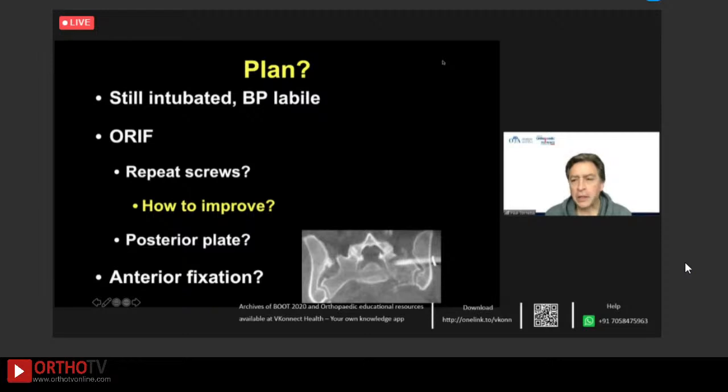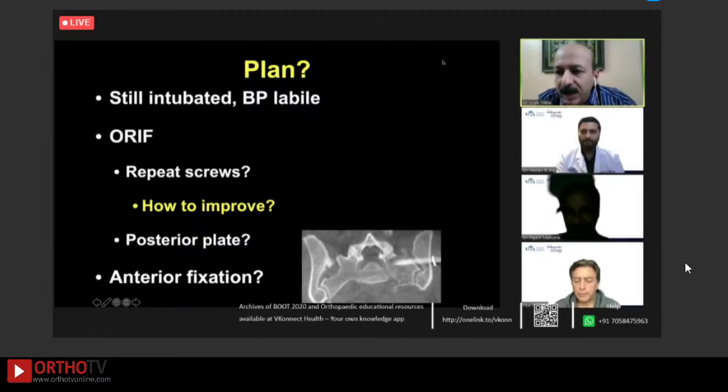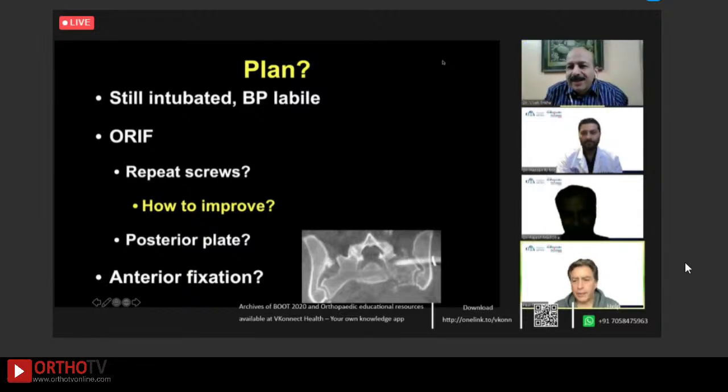In my hands, what we will be doing is, if possible, transsacral screws in our present-day world, but not before 5 or 6 years ago. But what we normally do is put in a transiliac plate. I normally reduce these fractures in a prone position, see the fracture reduced properly, then take out a small piece of the PSIS as a window and slide my plate down, as Lindorfer from Austria described in JOT. That's how we put in a transiliac plate, which holds it. You can say it's a cheap version of a transsacral screw, but it helps a lot for rotation.